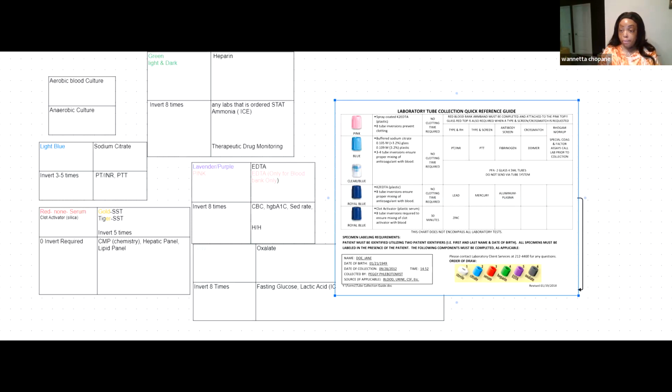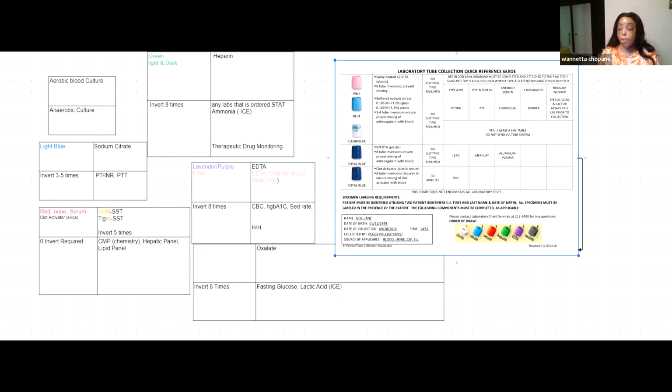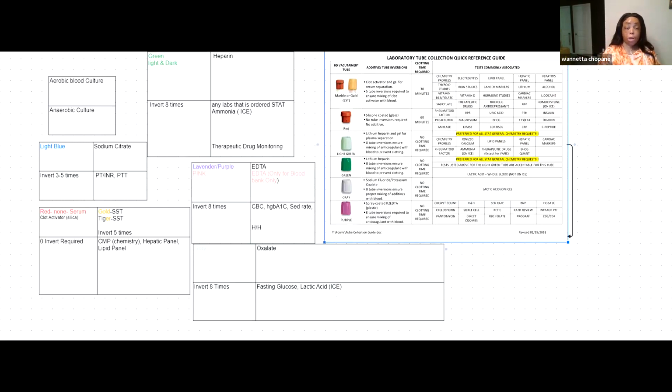All right. Moving forward, your next quiz is the order of draw quiz. I do want to be sure that you understand, and then just let me know if you have any questions. Now, moving to the last main order of draw.